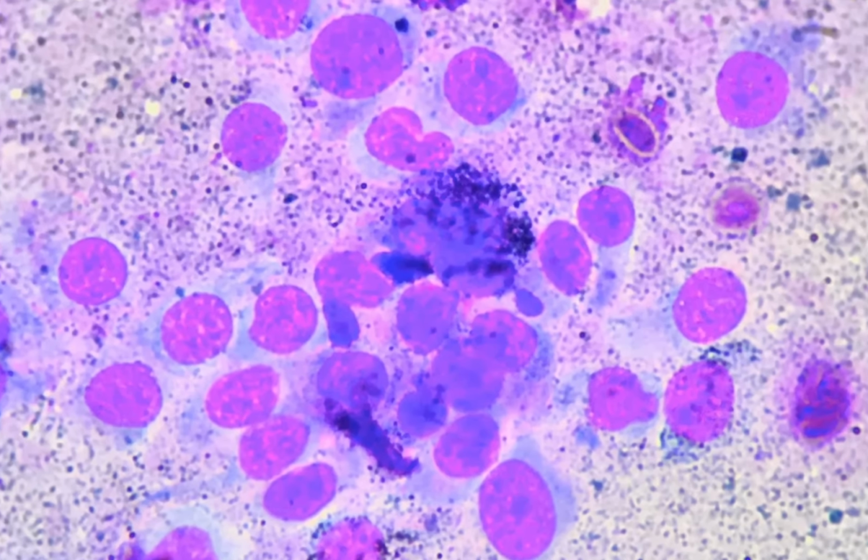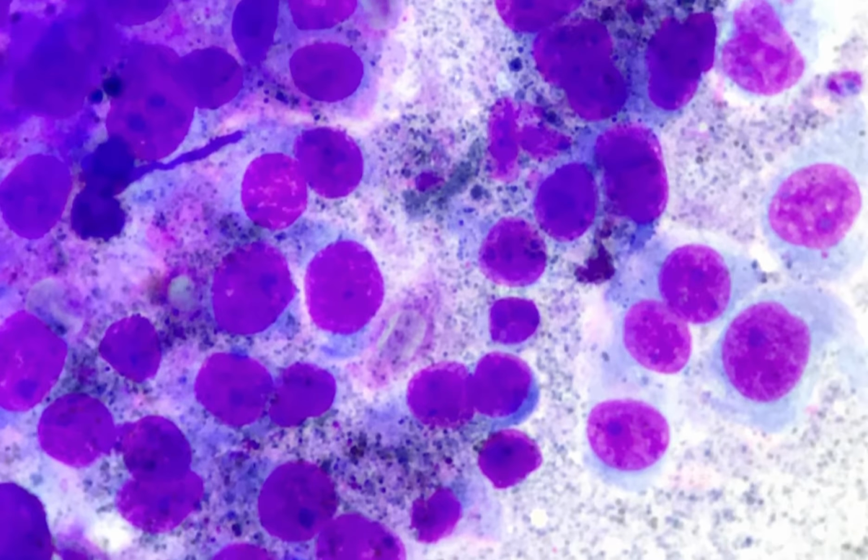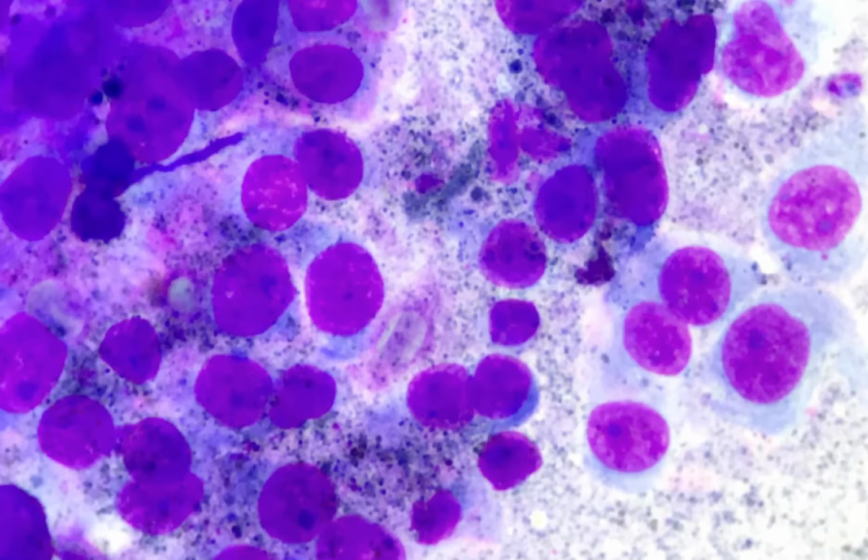And we have another picture of the same cytology. The cell over here has abundant melanin granules, but not other cells. But other cells do show marked anisocytosis, variable nuclear cytoplasmic ratio, and prominent nucleoli, multiple nucleoli. So all these features support malignant melanoma.